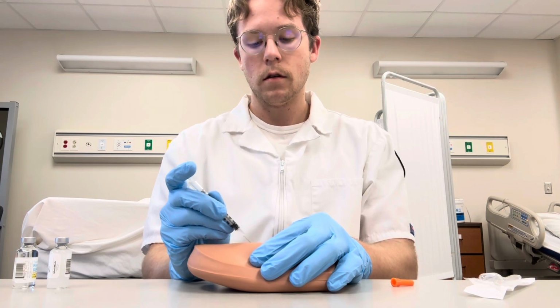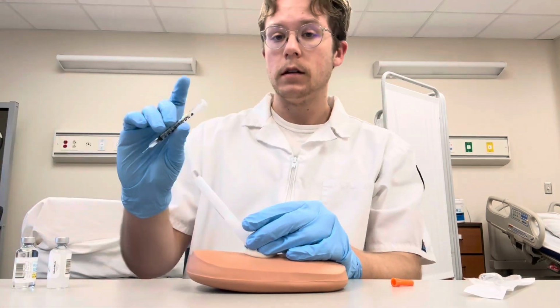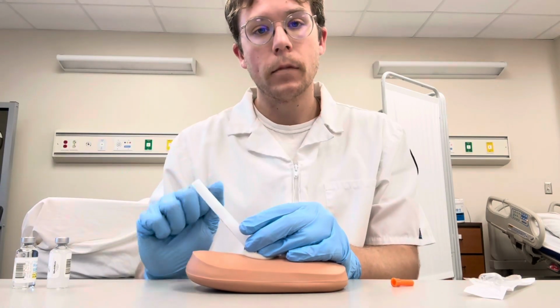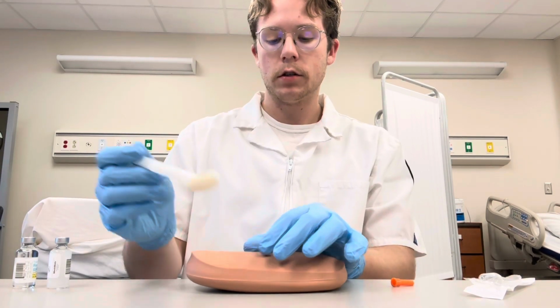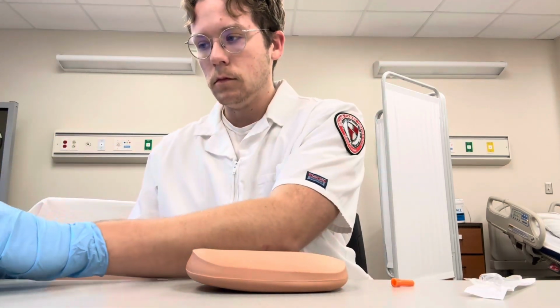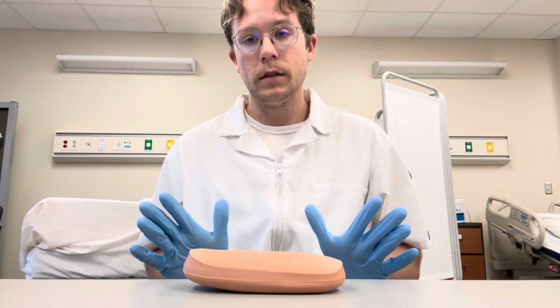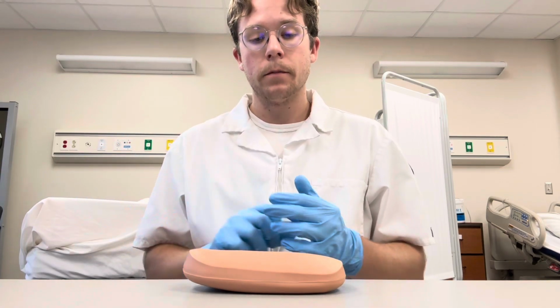All right. And we'll cover that up with our alcohol wipe, and dispose of our syringe into the sharps container. All right. And then we will make sure that there's no bleeding at the site. Done with our vials. We'll ensure that the patient isn't having any kind of reaction and that their symptoms are improving.